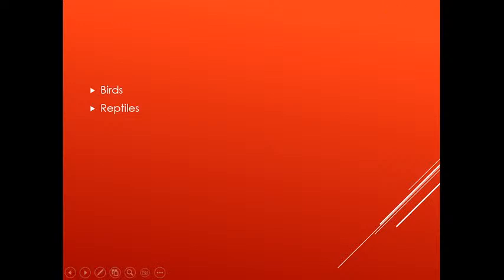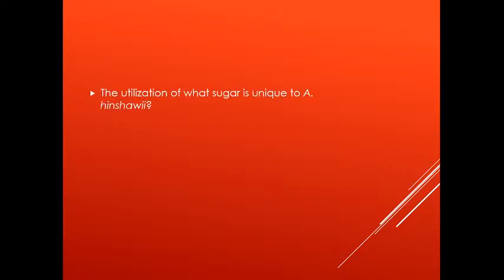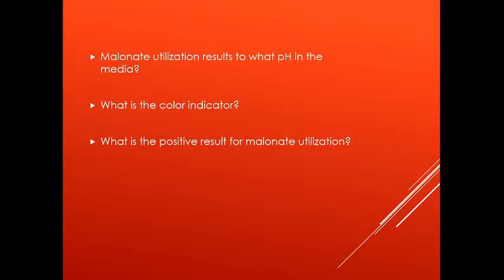Okay? So, who are the people at risk for contracting infections associated with Arizona? People who handle animals, right? Like zookeepers, veterinarians, or veterinary technicians. Now, utilization of what substrate is unique to Arizona hinshawii? It's actually malonate. Okay? Malonate utilization turns the media alkaline.